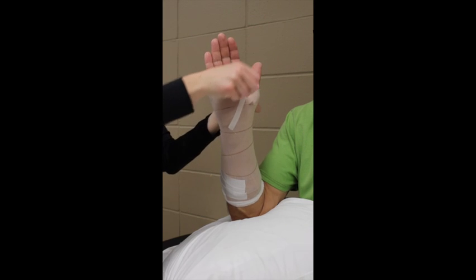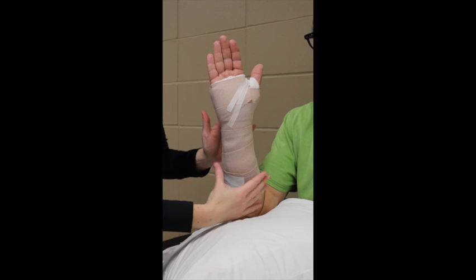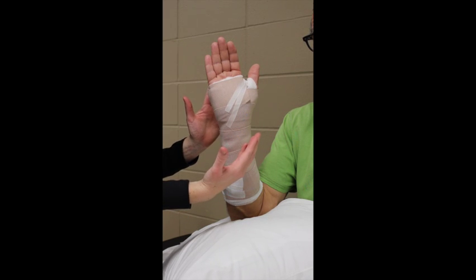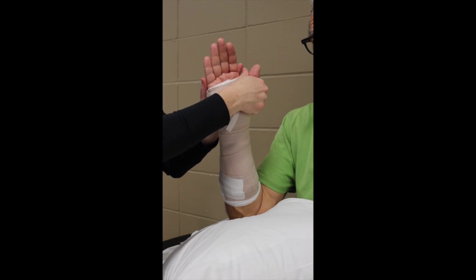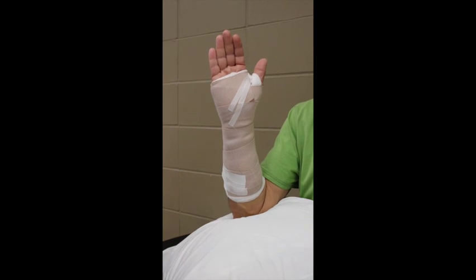I call this tape art — you can get creative. Because the splint is hard on one side, it allows for swelling to fluctuate. I make sure the wrist is in a neutral position, not ulnar or radially deviated, pronated or supinated. I use my thenar eminence to mold the splint into the palm. It is not necessary to do any other squeezing or molding.